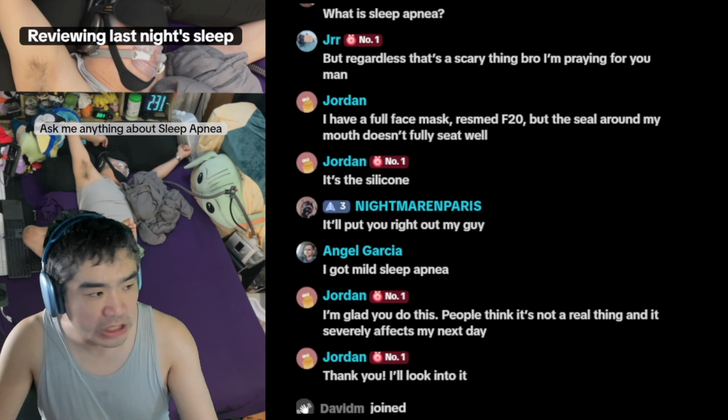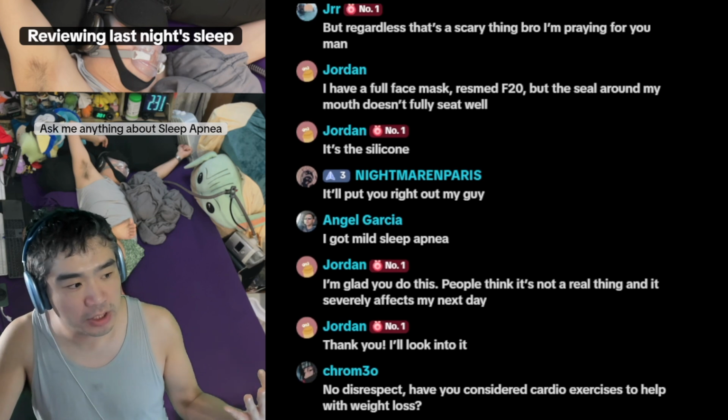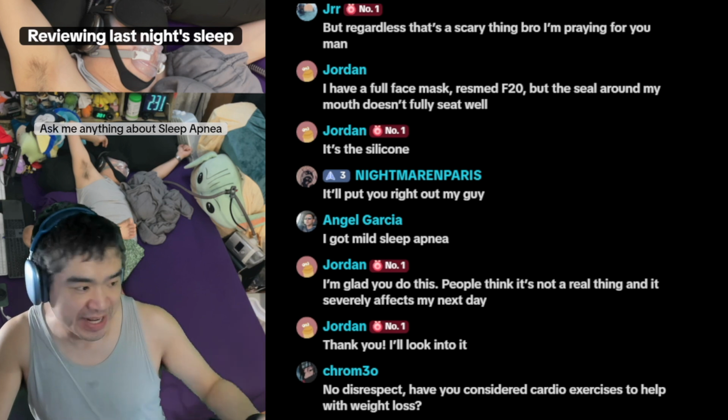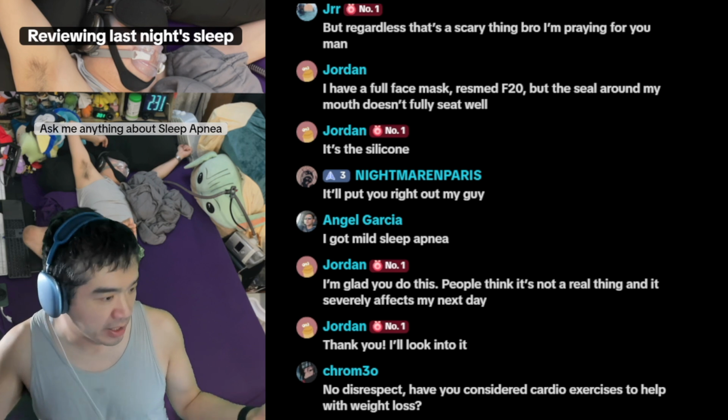Yeah, and definitely talk to your doctor. Don't go out of pocket to try it, because you want your resupplies to be that same mask. You don't want your resupplies to be a mask you're not using anyway.